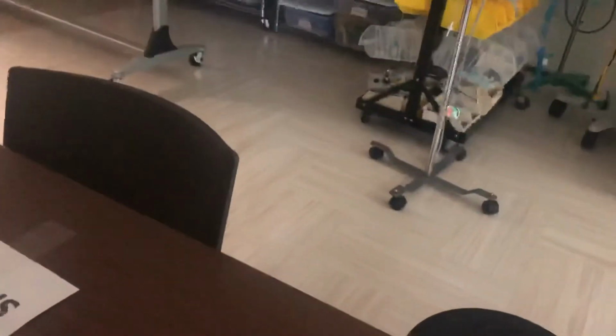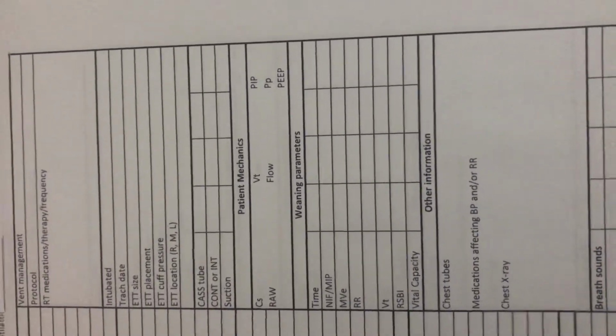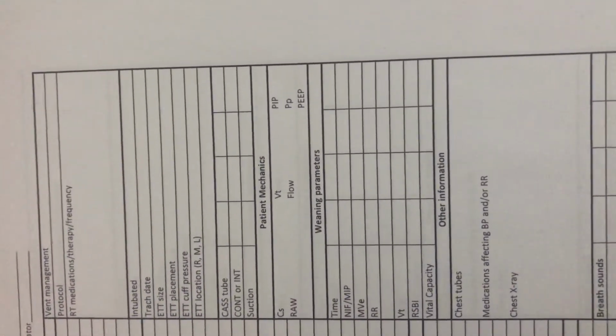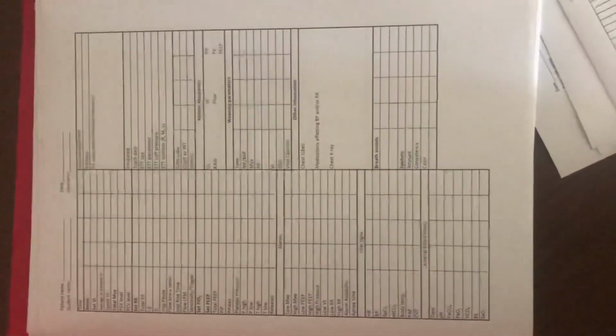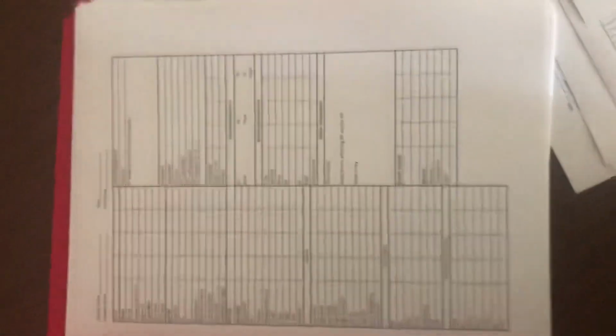We will walk over here and show you on your video on the weaning parameters ventilator sheet. To the right here, it says time, and then there's minute ventilation and respiratory rate, tidal volume, and then an RSBI calculation, okay? You need to be able to calculate this as well as document it appropriately, and then tell me what you are going to do with the results. And that's it.